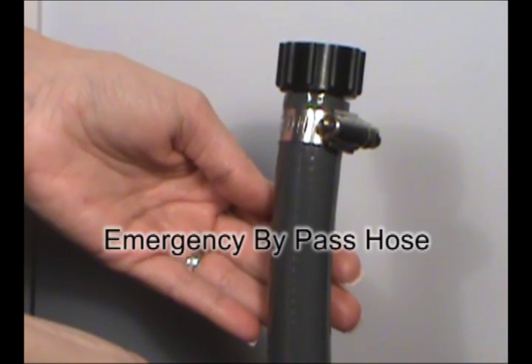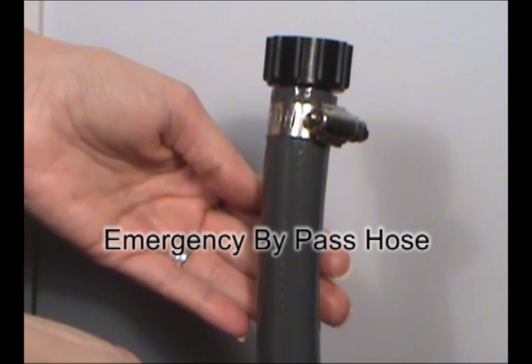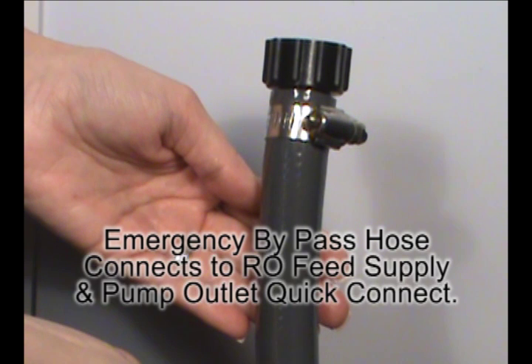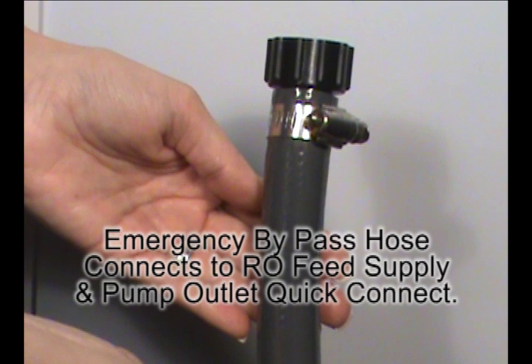An emergency bypass hose is provided in the rare event the system stops and you need to keep water flowing to your machines. The hose connects to the RO feed supply garden hose fitting and to the pump outlet quick connect, temporarily supplying tap water to your equipment.